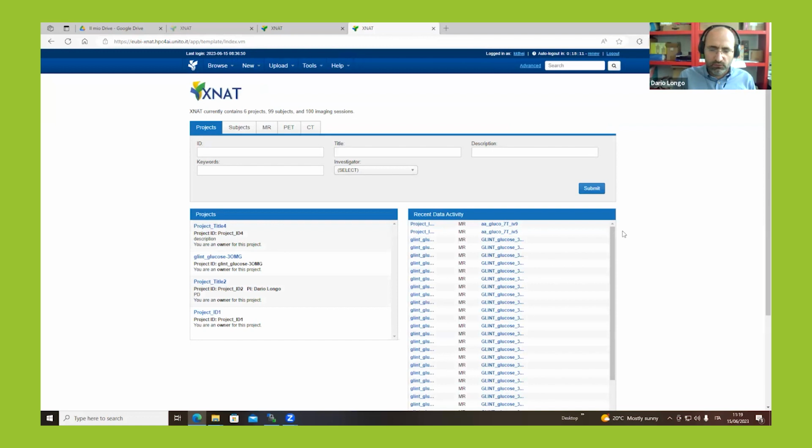And one question from the audience, Daniele Panetta. Yeah, I can read it. Any hint or warning if you are planning to migrate an entire old project from an old repository to XNAT? Is there some limitation on large uploading of data besides the disk space constraints?